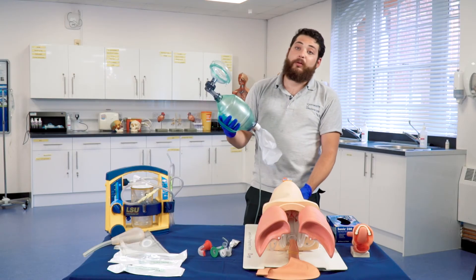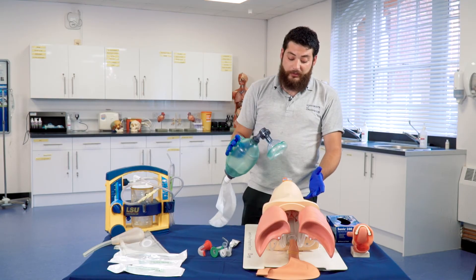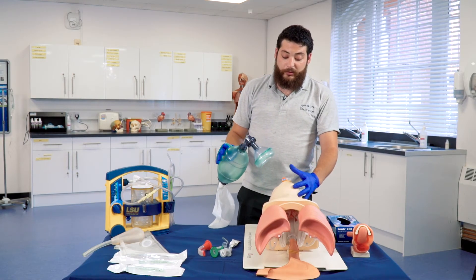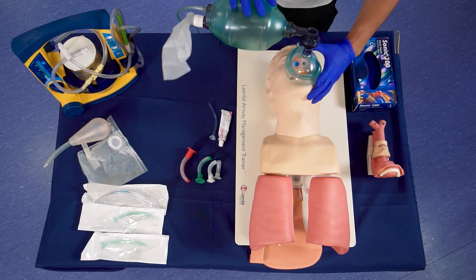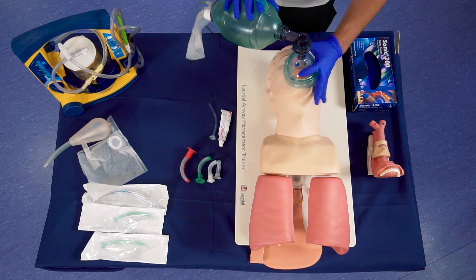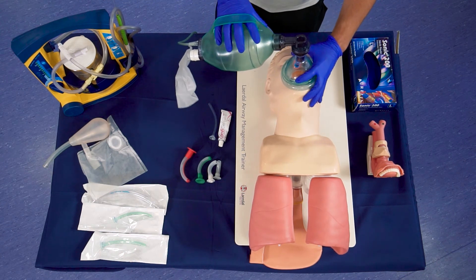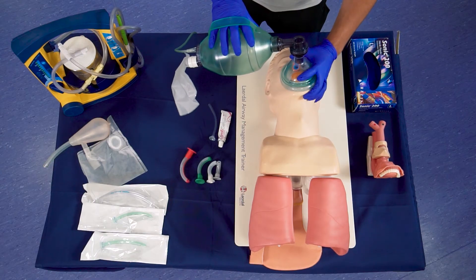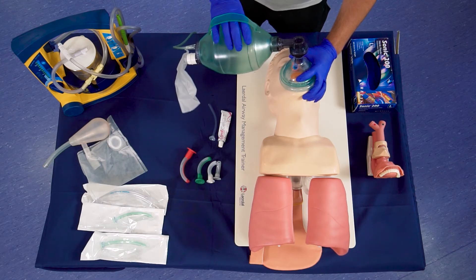We will be using our bag valve mask to oxygenate the patient. This is done by using what we call a C-grip, where these three fingers are placed along the jawline, and the C is done to create a seal around the mouth and the nose, and oxygen is pumped directly into the lungs.